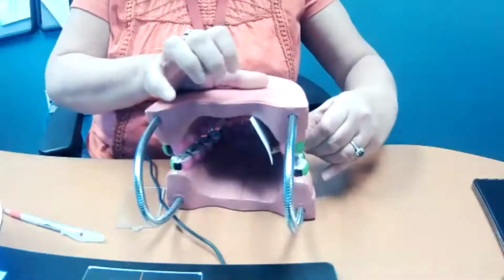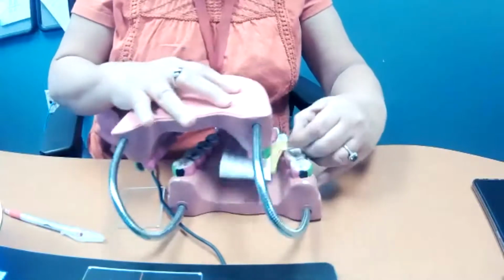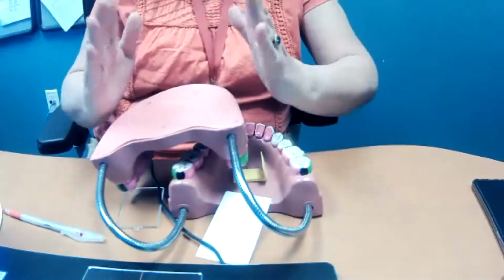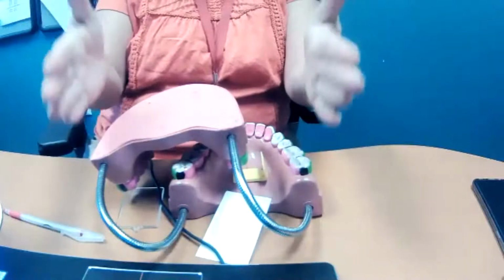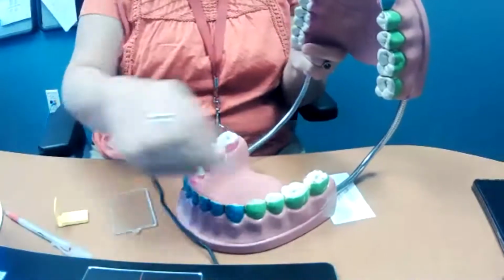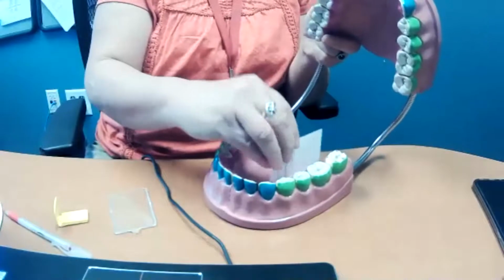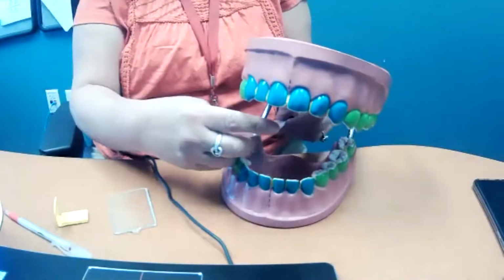And we also have to remember that the teeth on our maxillary go in our mouth this way, right? Because our maxillary is bent, right? It's not straight. In our mandible, our teeth are straight up and down like this, which is good because underneath our tongue is all muscle. And so our film won't bend when we put it on our mandible. Okay, so some of the hardest teeth to take x-rays of are going to be on your maxillary.